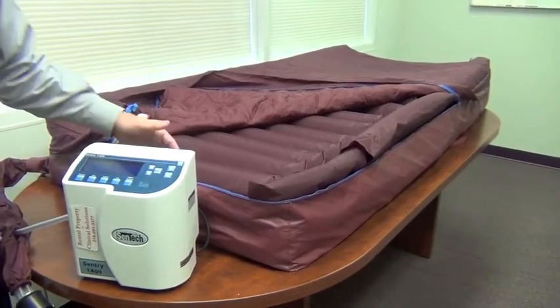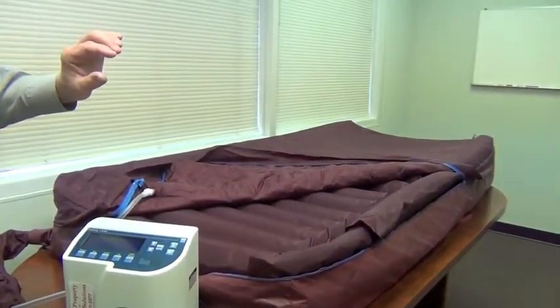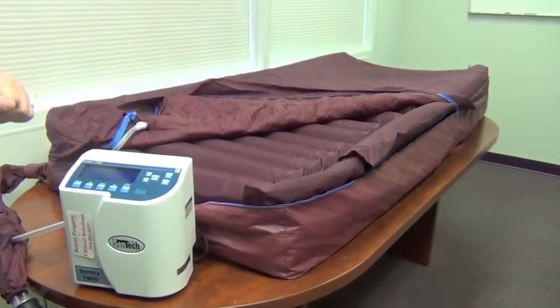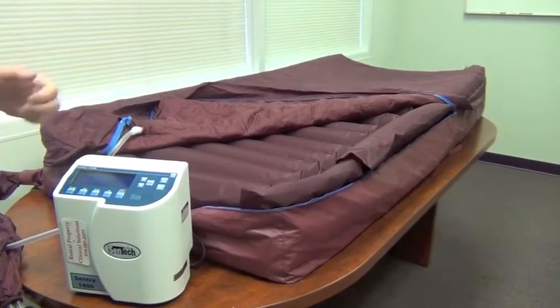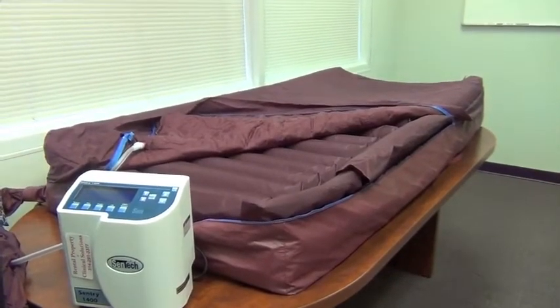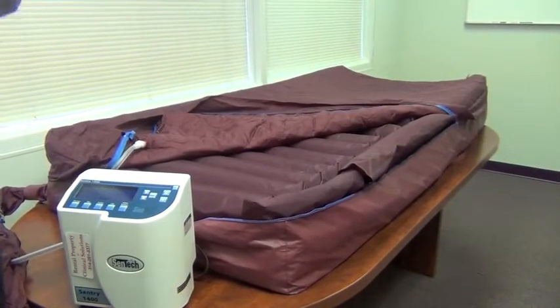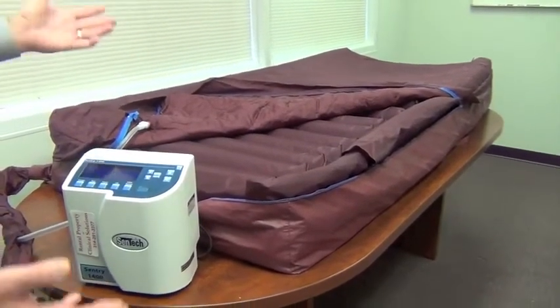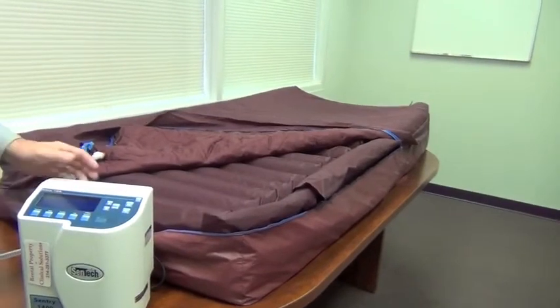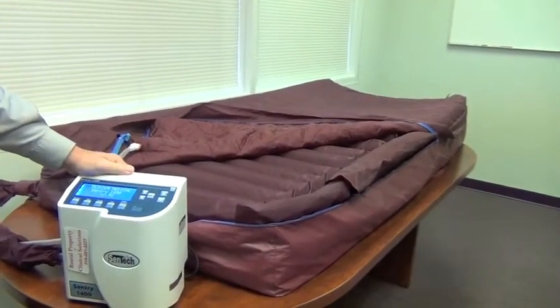So we're that much closer to the ground, and in the base of the mattress is a nylon covered piece of foam, which gives this system the property of a stretcher or a gurney. So it's not therapeutic, but it's not uncomfortable either, and it's adequate for padding when you're doing a transfer. So with the product deflated, bring the patient to a seated position, and you can do a pivotal transfer, you can do weight bearing, whatever is indicated. When you return the patient to bed, they're seated, swing them to a lying position, come down here, again, reconnect your air supply here on the side and power the unit up.